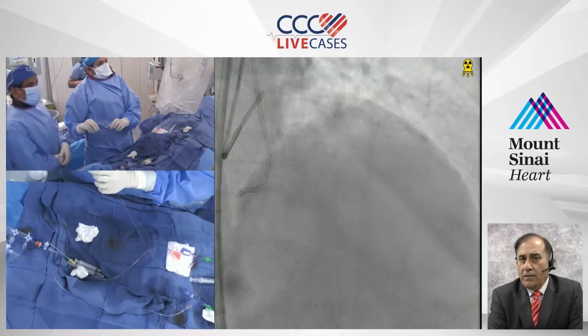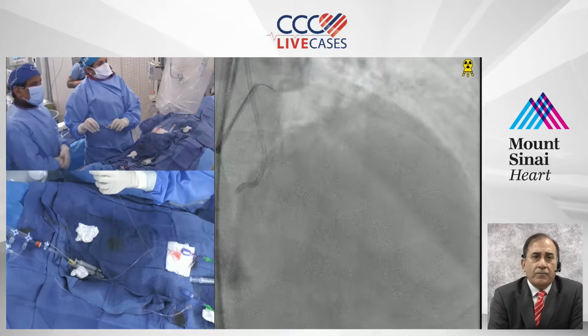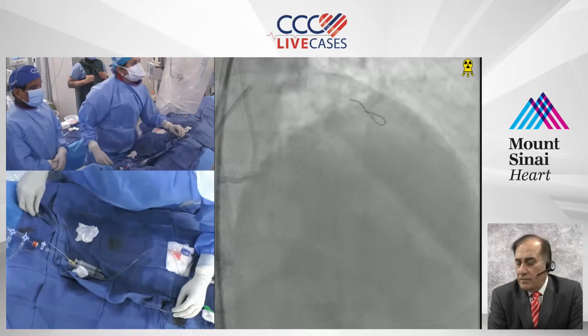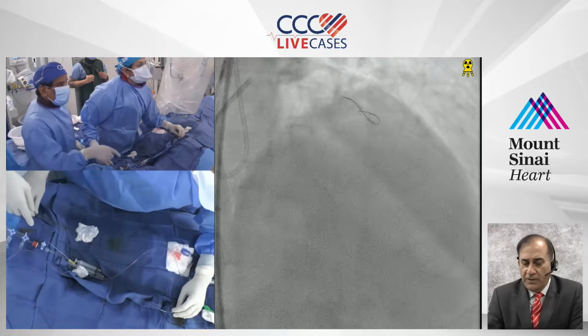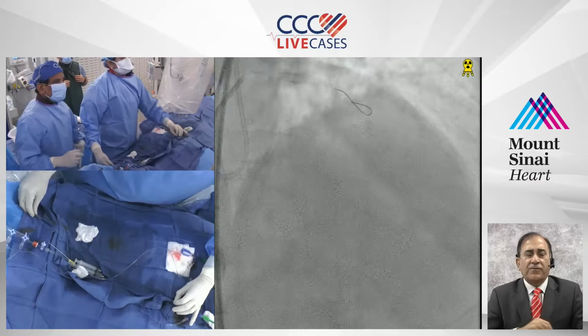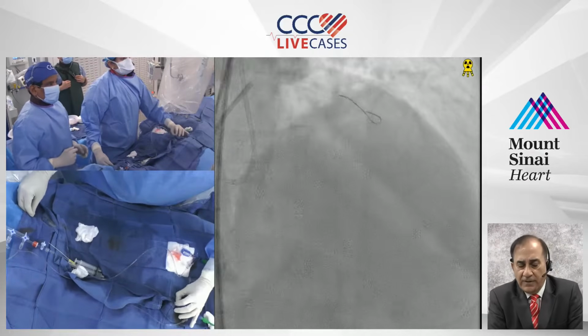But Fielder, I mean, to me, in that situation, it's actually far superior to Whisper. Let's see with this one now. Hope it goes further with this. Yeah, useful tip for people because that happens often.